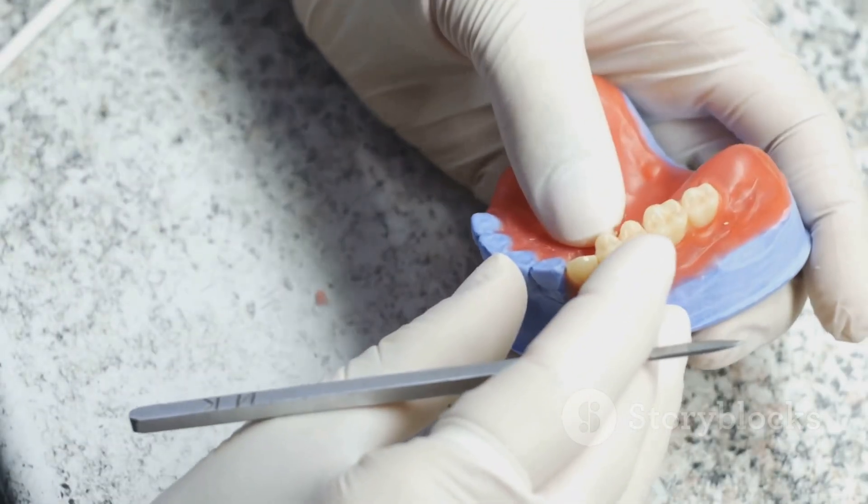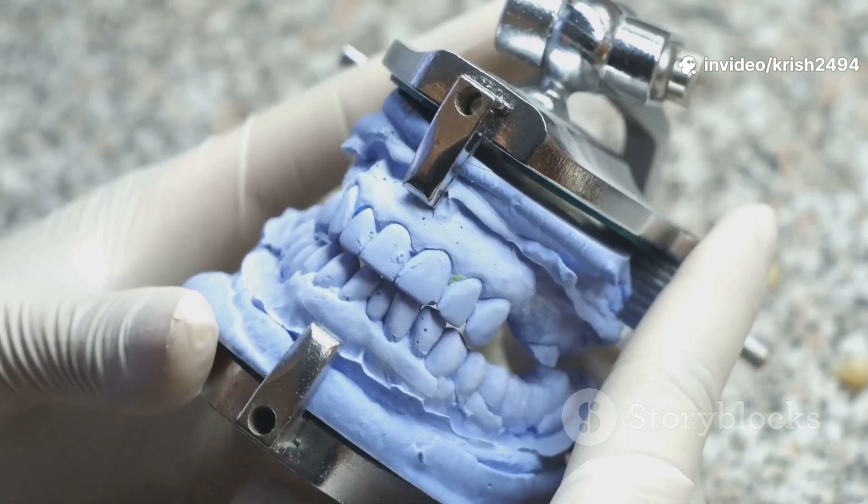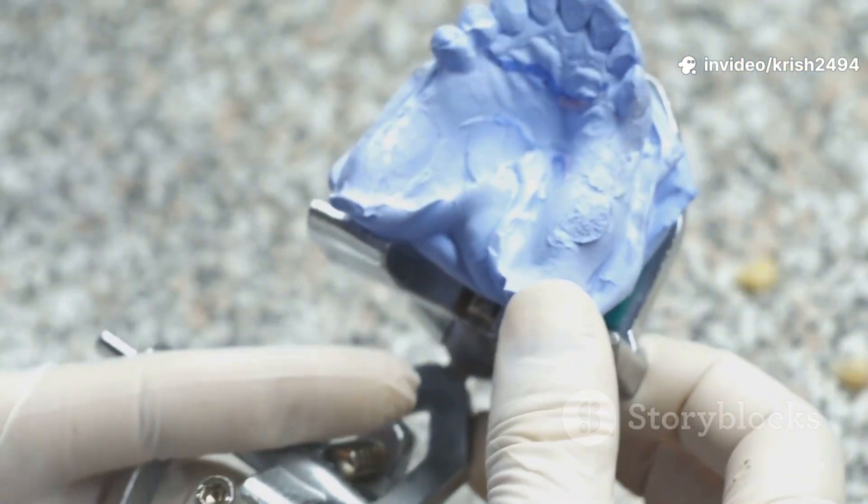Next is packing with acrylic resin. The lab fills the mold with pink acrylic resin, closes the flask, and cures it under heat and pressure.